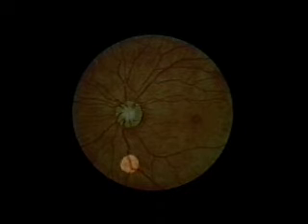While holding the red reflex in view, approach the patient's eye along a 15-degree line lateral to her line of vision until the ophthalmoscope is close to the eye. Try to find the optic disc by following the retinal vessels toward the place where they converge. Now bring the optic disc into sharp focus by adjusting the ophthalmoscope lens.